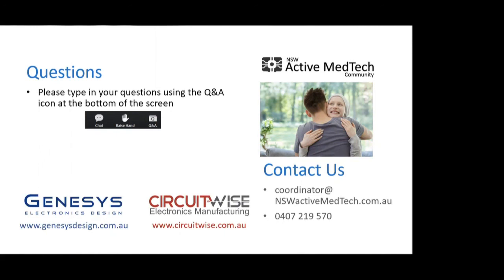So we went for CE, particularly MDD, because that was relatively simple. We had to prove efficacy and capability within a limited range. It also gives you access to the Australian and New Zealand markets, which we wanted because they're our home markets, and we want to support those. They're good for doing a lot of early sales into. And CE also gets into a number of other markets globally. There are people who line up with a CE style of regulation, and there are those that line up with FDA. And so we pushed FDA out.